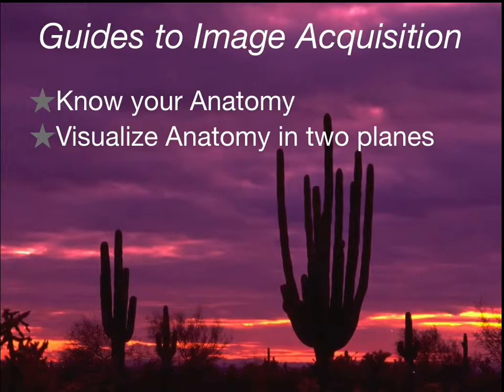Kind of like when you push on the abdomen with your hands without ultrasound, like back in the day when you're doing the physical exam, you're thinking back into your mind's eye, I wonder what's underneath my hands right now. Well, with ultrasound, you're actually seeing what's underneath your probe hand. And as you fan through these 2-dimensional planes, you're reconstructing all of those anatomical structures in your mind, which is why it's so important to teach ultrasound while you're teaching anatomy to students.